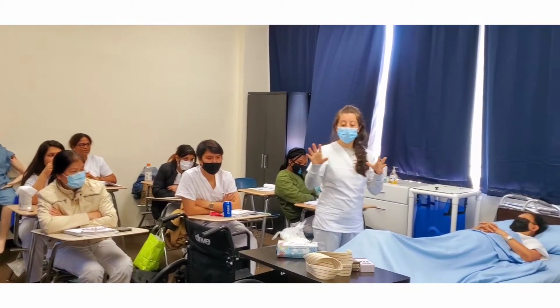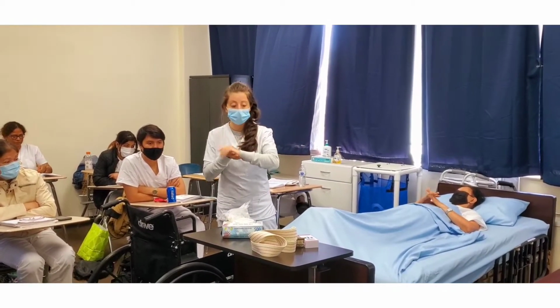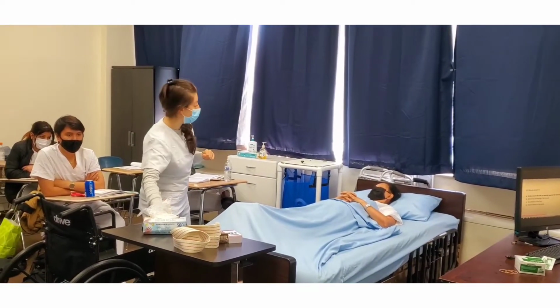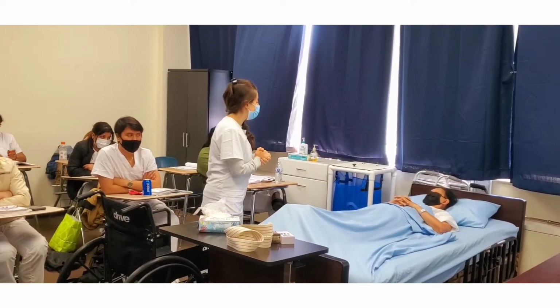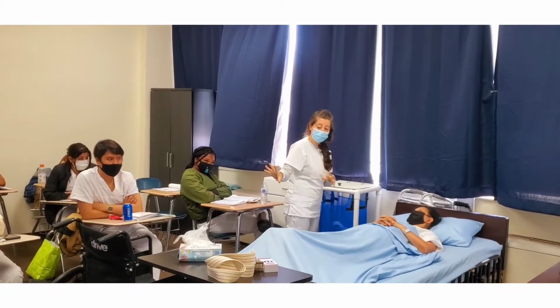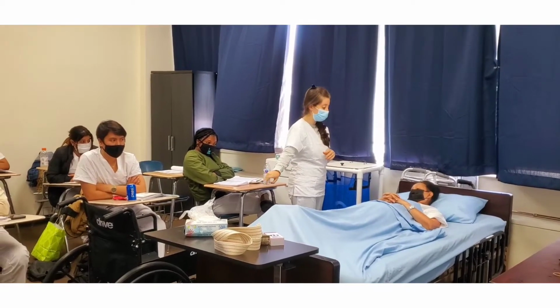Okay, so I'm going to come back now to the patient. My hands are washed. We're going to pretend that I washed my hands for this skill. So I'm back. I'm going to knock. Miss Carpio, can I come in? Yes, please. Okay, so I washed my hands. I gathered my supplies, which is the gait belt only, and the wheelchair is ready for us.